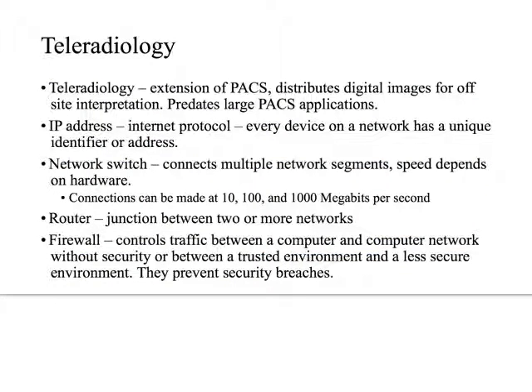So let's talk a little about teleradiology. This predates PACS, right? Teleradiology came before PACS, and it was a way to distribute images over phone lines. That's why the tele is still out there. To this day it relies on IP addresses, so internet protocols, as well as network switch routers and firewalls. Teleradiology is typically the way that people do Nighthawk reading or off-site reading, largely for security reasons as well as for software connectivity.